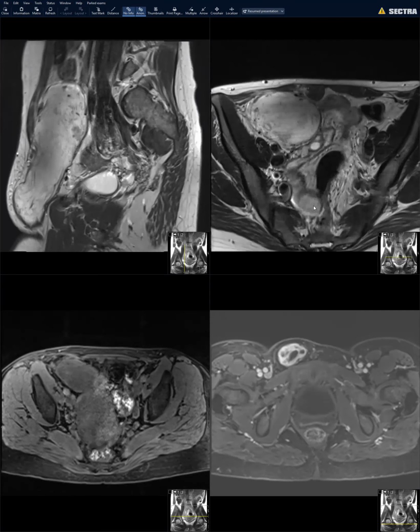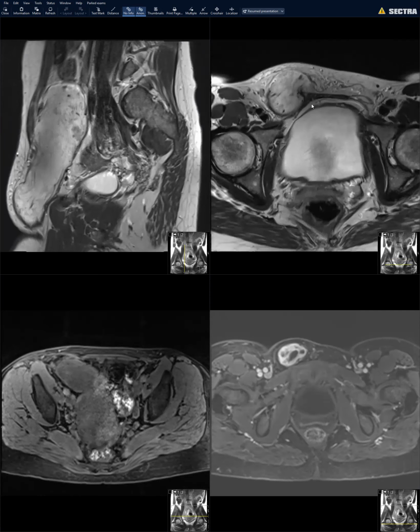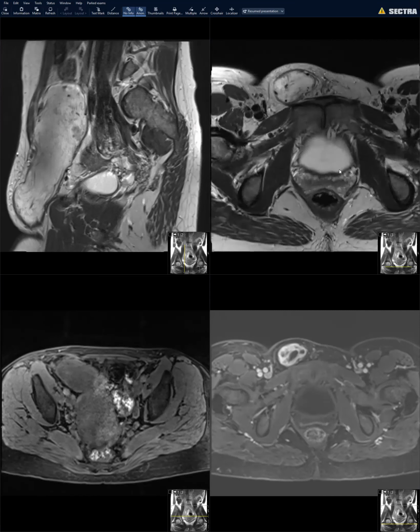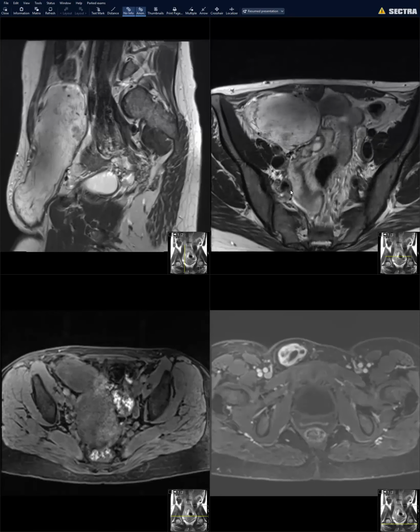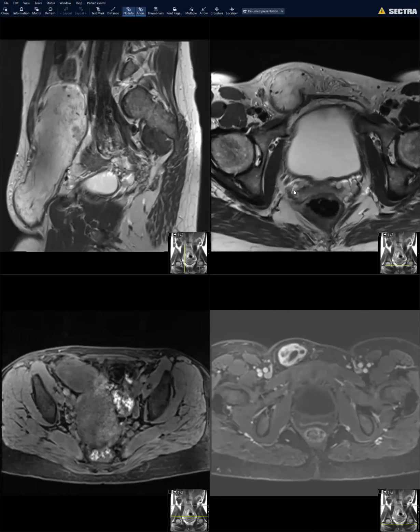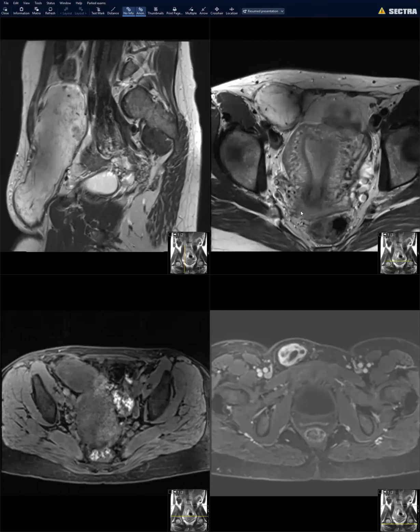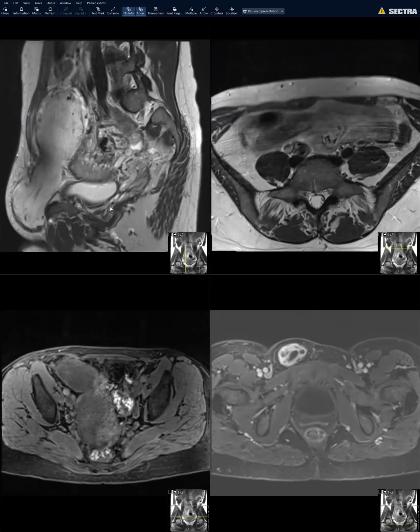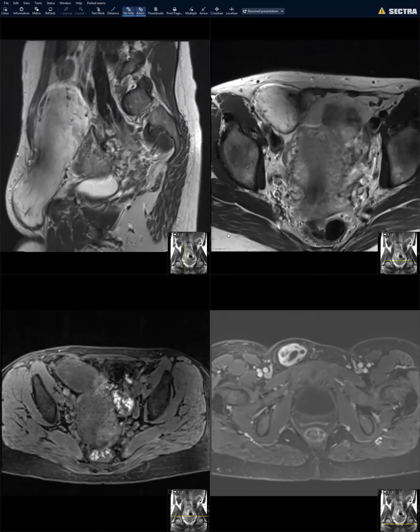Angiomyxoma is another good thought. Angiosarcoma is another thought. And all these tumors happen kind of in and around the pelvic diaphragm, either on the bottom side or on the top side. So when you see these large vulvovaginal or perineal masses with so much heterogeneity and flow voids, two big things to think about are SFTs and these aggressive angiomyxomas and angiofibromas. They're kind of along a similar spectrum. Let me show this next case.